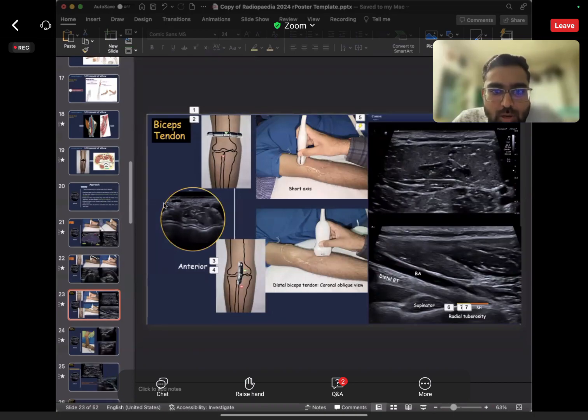Yes, it is possible to exclude injury or tendinosis of the common extensor tendon origin from any associated adjoining injury of the lateral collateral ligament. The lateral epicondyle is one of the challenging structures to image because the small ligaments are very difficult.